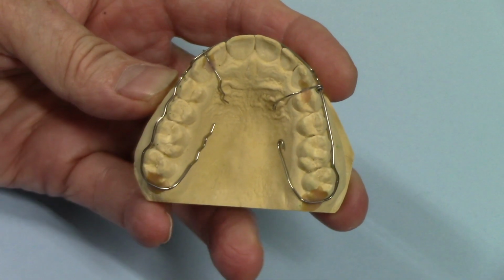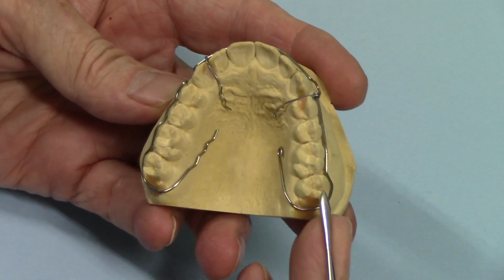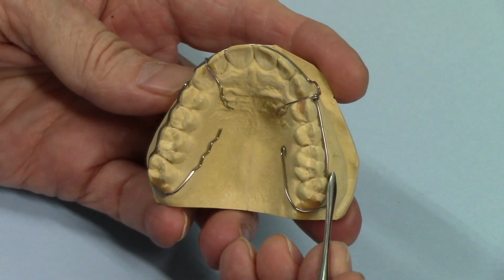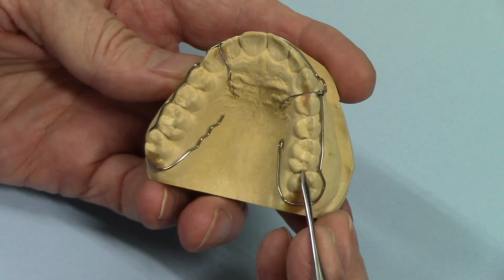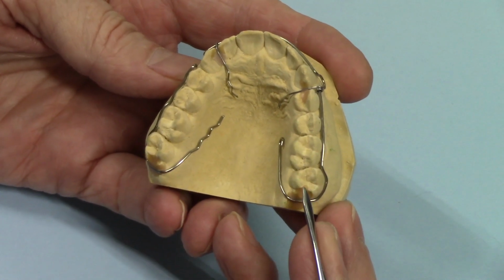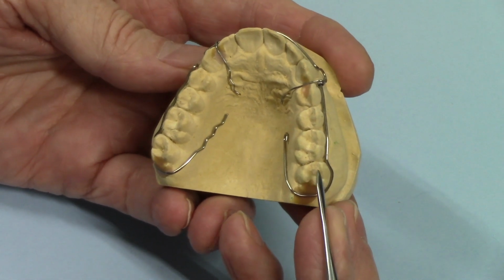This is a mock-up of a traditional wraparound retainer design that I came up with. This isn't a real case, it just shows some different features. The purpose of the wraparound retainer is to provide post-ortho treatment retention and minimize or eliminate the wires that cross over the occlusal, especially in the posterior clasping area, so that it allows the posterior teeth to settle in unencumbered.